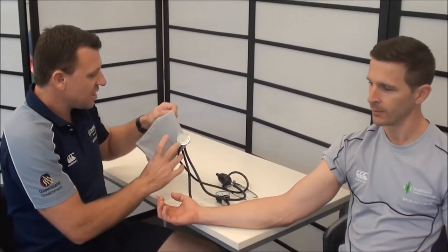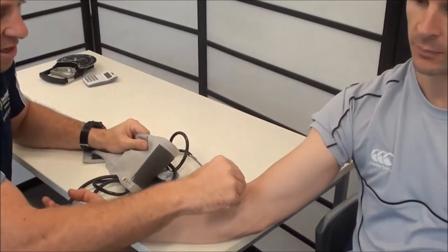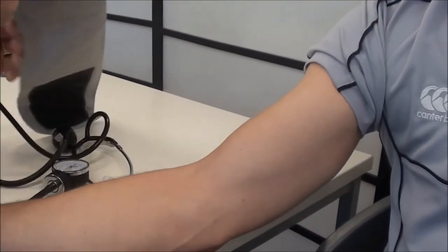One thing I would ask Weston to do is roll his sleeve up slightly, because we really don't want clothing underneath the cuff if we can avoid it. With the cuff itself, we're going to be placing it about an inch above the elbow crease — the bottom edge will be about 2.5cm above where the elbow crease is.